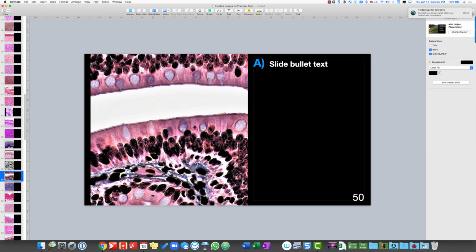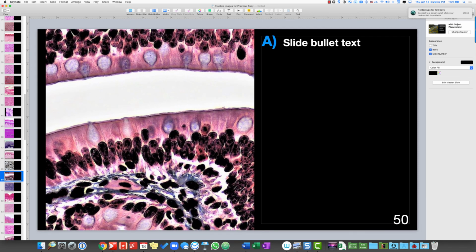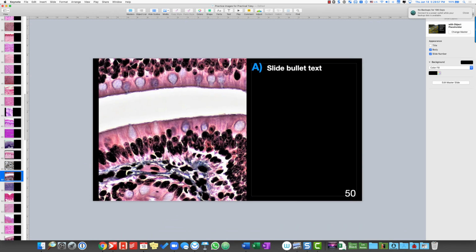But also, you can tell the shape of their nuclei are approximately the same. You don't see another layer of nuclei with a shape that's markedly different. So these are sort of the same shape of their nuclei, and you want to look at the tissue as a whole, not just focus on where you see could be confusing.